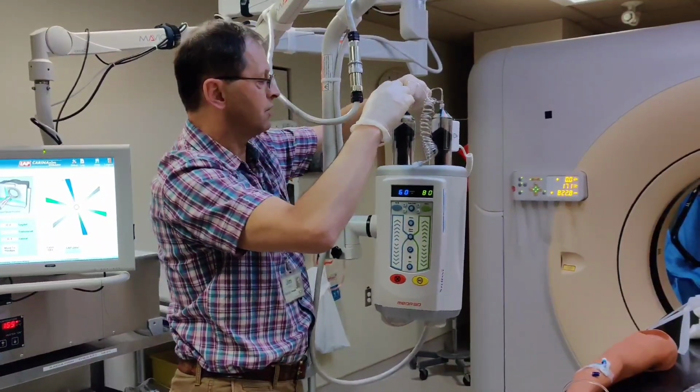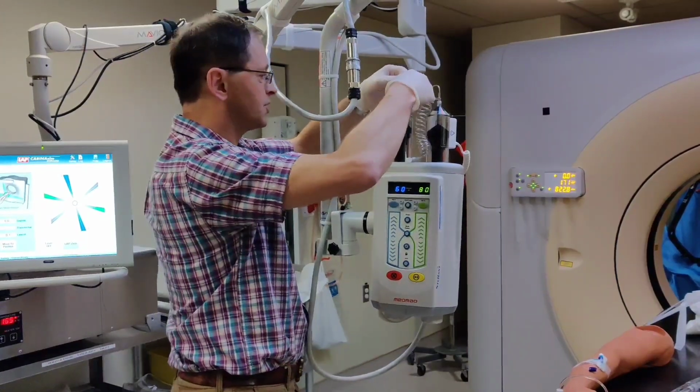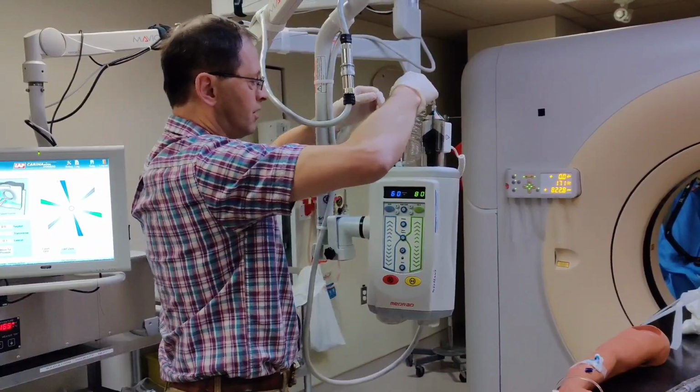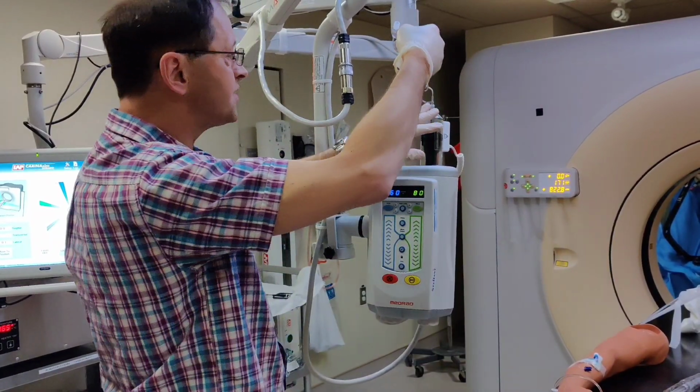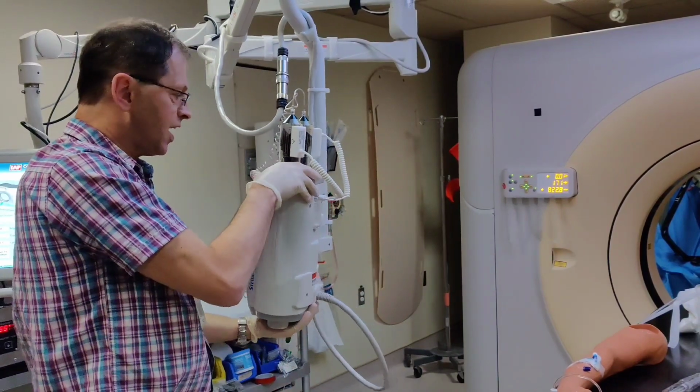Just tighten that down. Let me just double check that. It's a little bit twisted. There we go, that's better. So at this point, we've got this end connected. What we need to do is rotate the injector down.